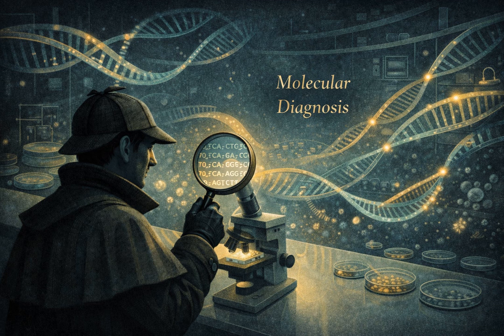But there's a catch, isn't there? There's always a catch. The main limitation is that you usually need a pure colony to start with. It doesn't typically work well if you just smear raw sputum on the plate, because you get a messy mix of proteins from many different bacteria plus human cells. So you still need the farming step first. For most applications, yes, though there are now FDA-approved protocols for using it directly on positive blood culture fluid, which, again, speeds things up tremendously. This brings us to our final and maybe most important section, Section 5.